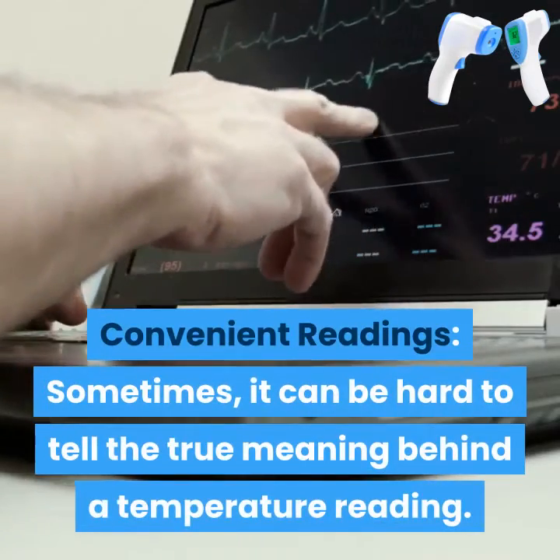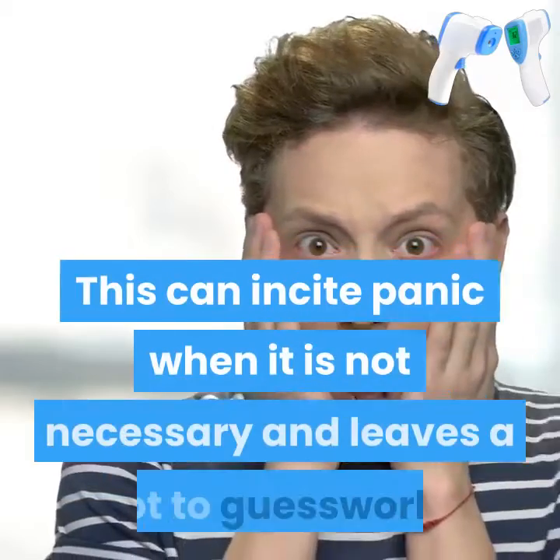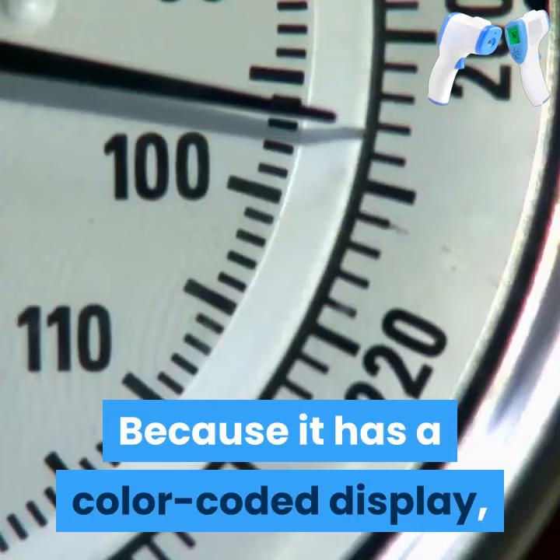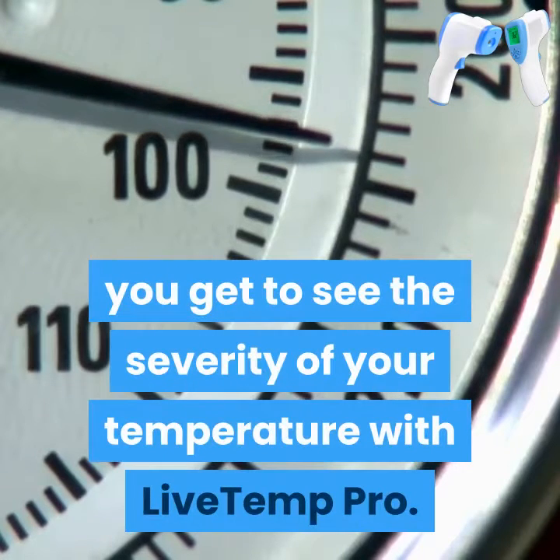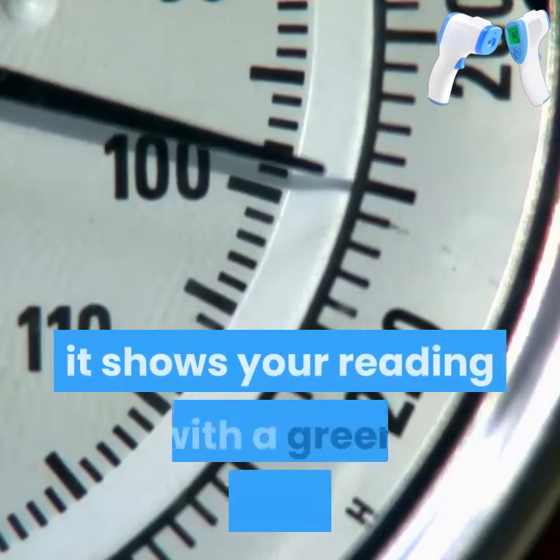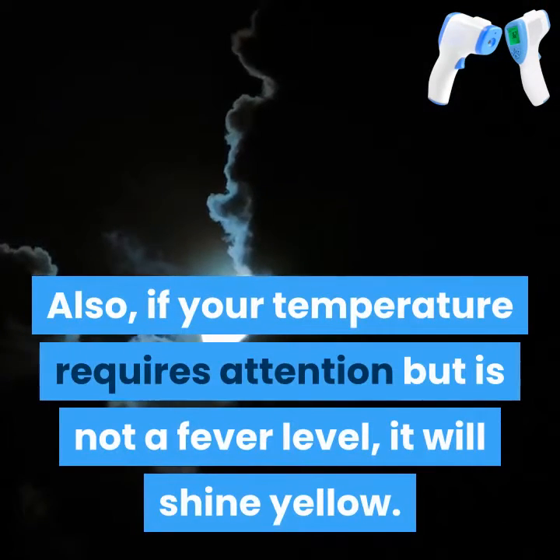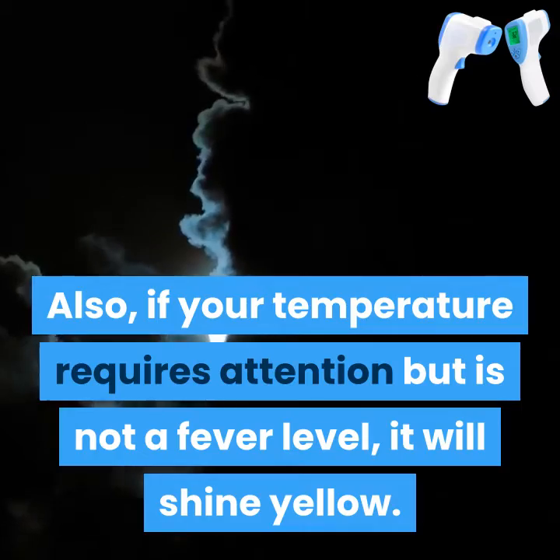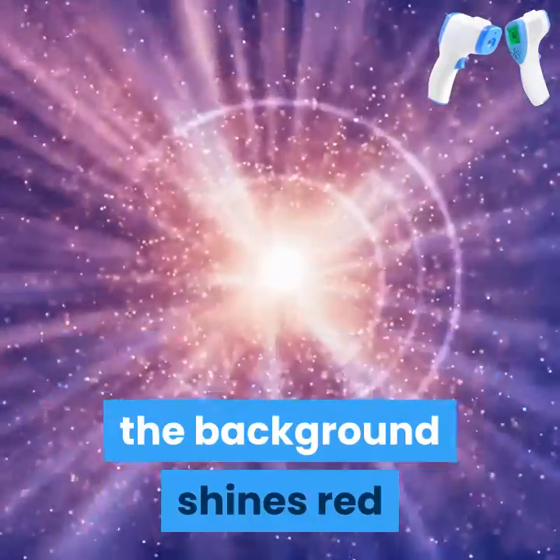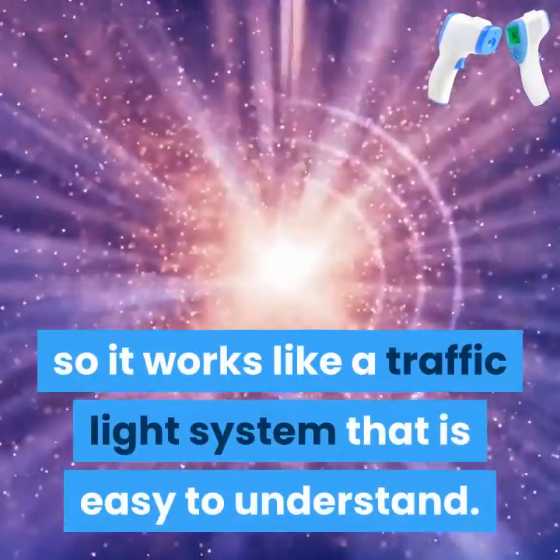Convenient readings. Sometimes it can be hard to tell the true meaning behind a temperature reading. This can incite panic when it is not necessary and leaves a lot to guesswork. Because it has a color-coded display, you get to see the severity of your temperature with Live Temp Pro. When you are fine, it shows your reading with a green background. If your temperature requires attention but is not a fever level, it will shine yellow. When you do have a fever, at 38.1 degrees Celsius to 43 degrees Celsius, the background shines red — so it works like a traffic light system that is easy to understand.